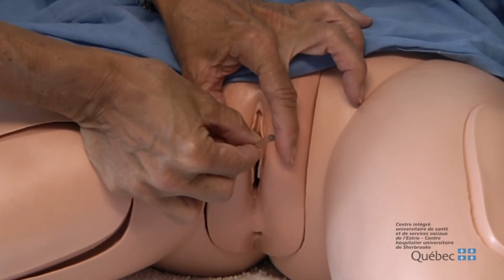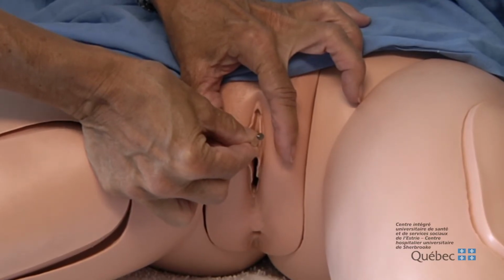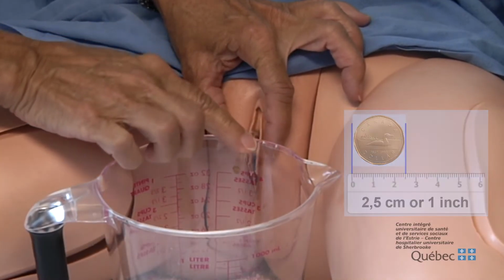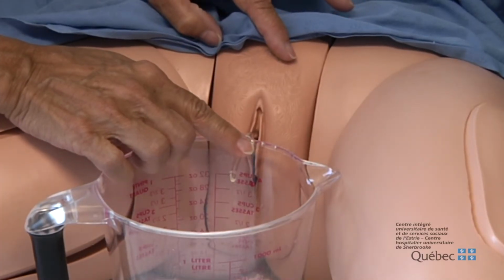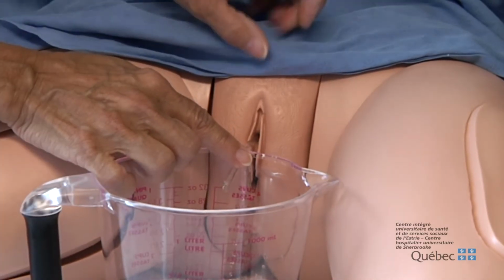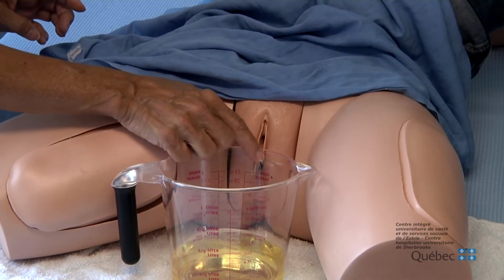Once the urine begins to flow, continue inserting the catheter about 2.5 centimeters more into the meatus. That's about 1 inch. The urine should flow into the measuring cup. If that's not the case, reposition the cup. Hold the catheter in place until urine stops flowing.